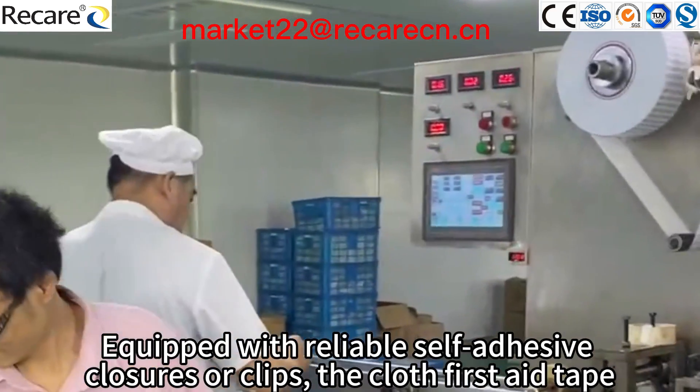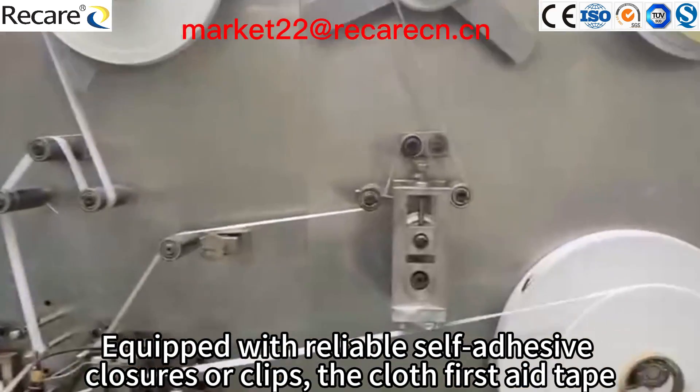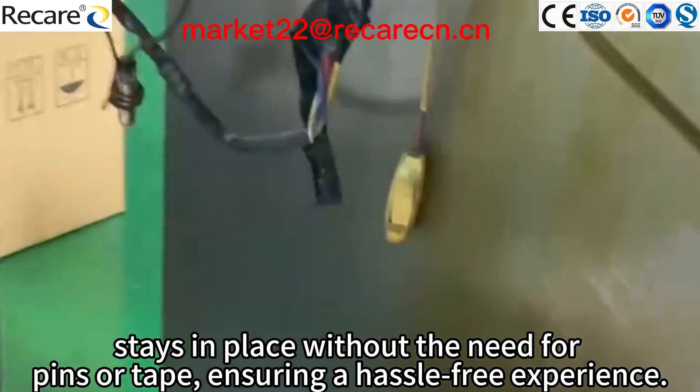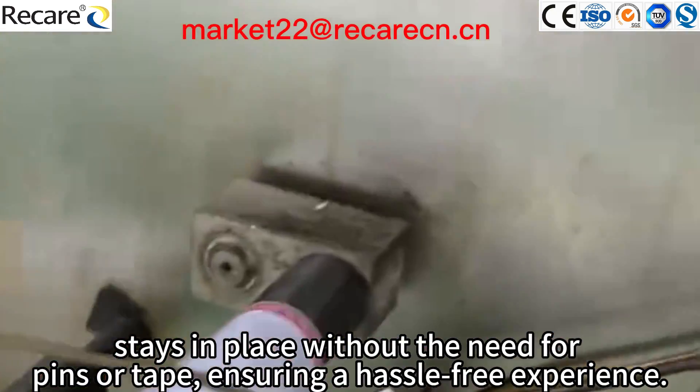Equipped with reliable self-adhesive closures or clips, the cloth's first aid tape stays in place without the need for pins or tape, ensuring a hassle-free experience.